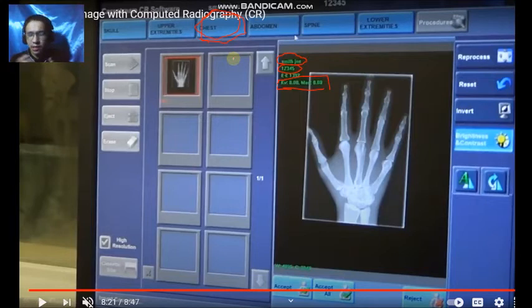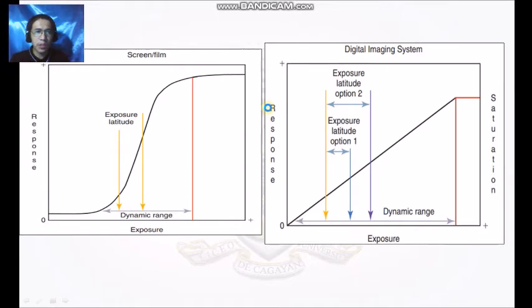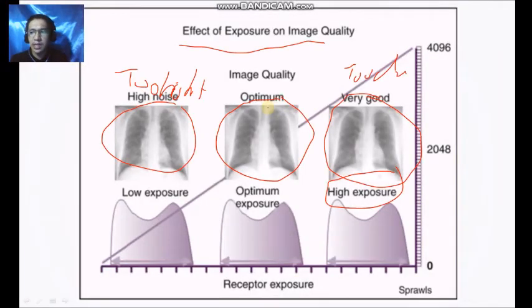Okay, the problem is the patient was overexposed, but when it comes to image processing, there is no problem with that. The rad tech picked the chest exam. And once the computer receives the image, since the examination required is chest, even if the factor was too high, even if the exposure was too high, it will display the optimum amount of contrast and density on the monitor.